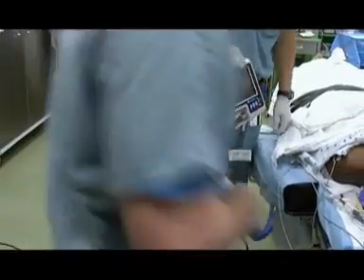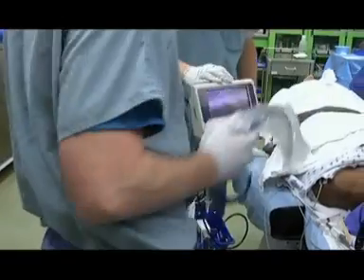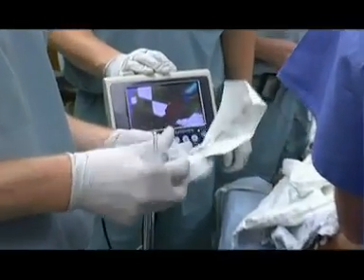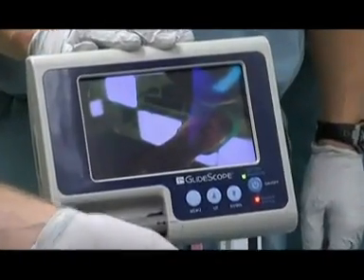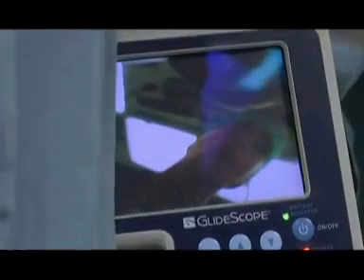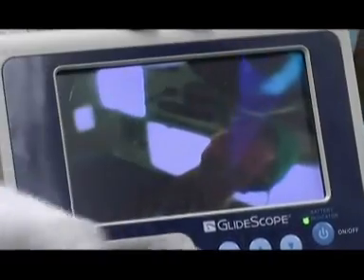During your clinical experience at the University of Kansas Medical Center, utilization of Glidescope equipment will facilitate safe airway management in the perioperative period. Prior familiarization will smooth its initial use and facilitate adequate clinical performance.